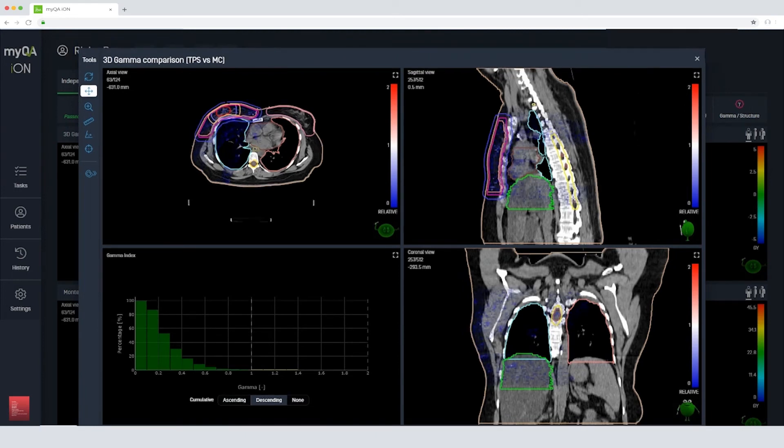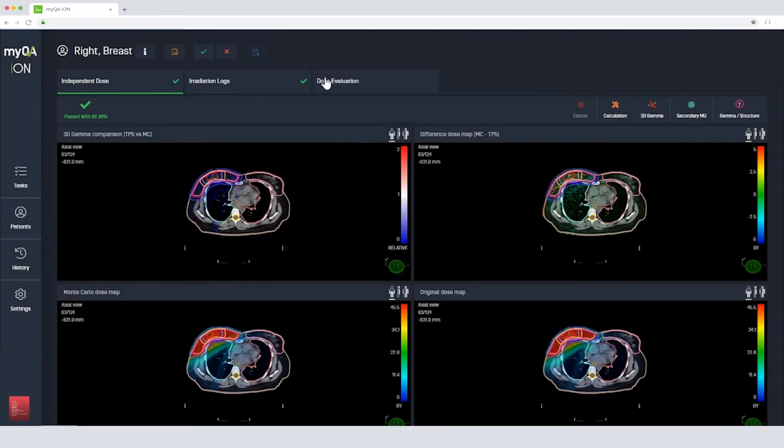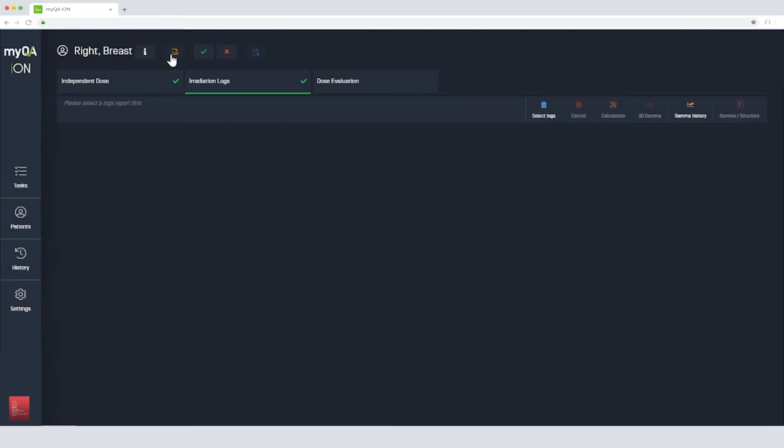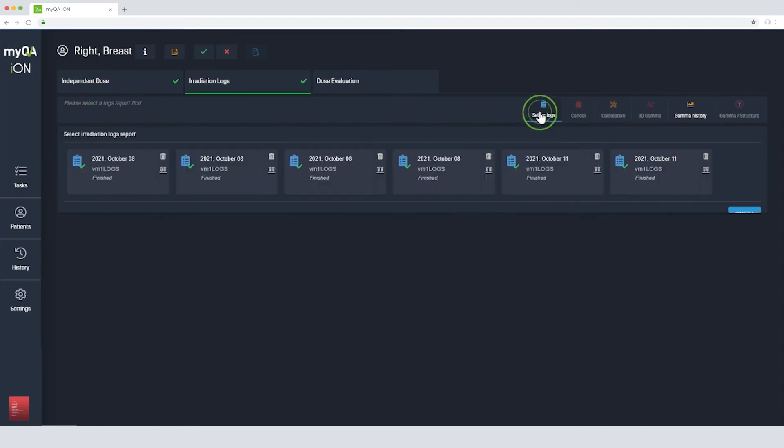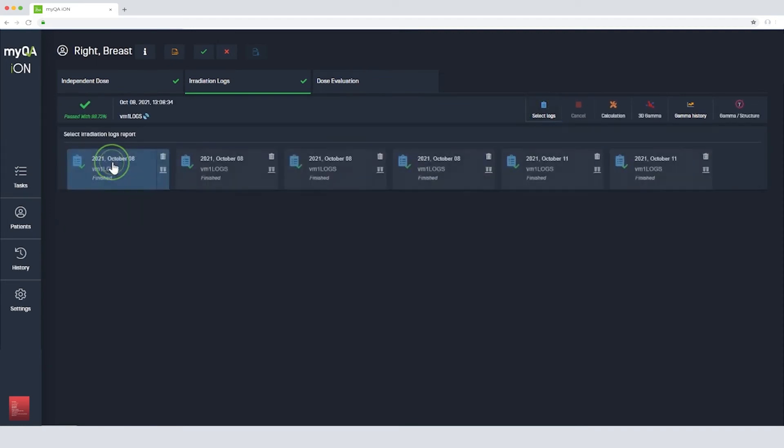The next step is to look at how we can review the plan delivery during the patient's treatment. To do this, we use the log files direct from the treatment machine. Here we have several log files for a patient who is receiving treatment.